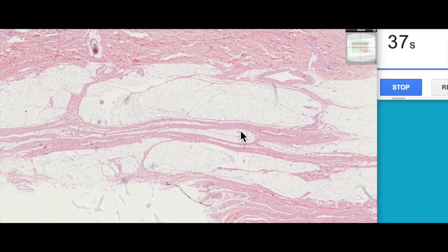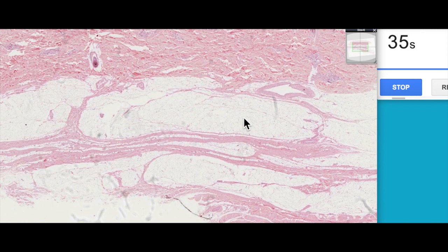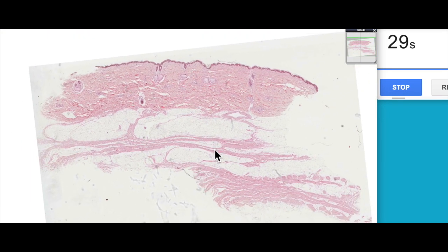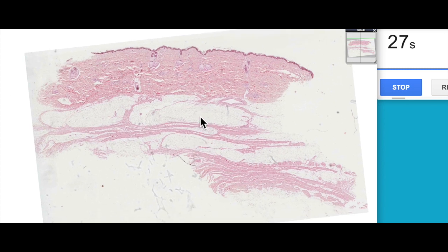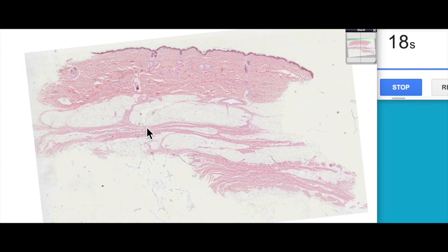There's a little bit of controversy in the literature about the naming of these different layers. Some anatomists and gross anatomy textbooks refer to this entire region as subcutaneous areas or superficial fascia, whereas some anatomists refer to this connective tissue band as the superficial fascia and then potentially the deep fascia down here.